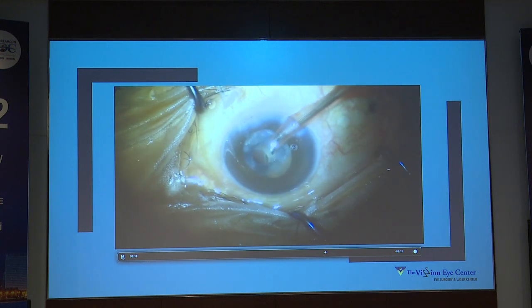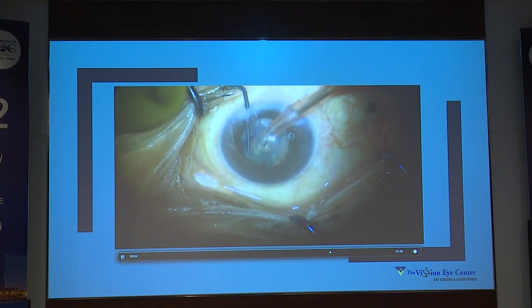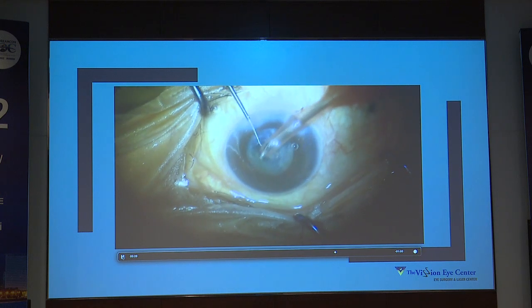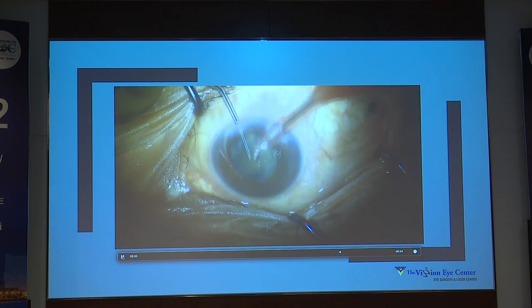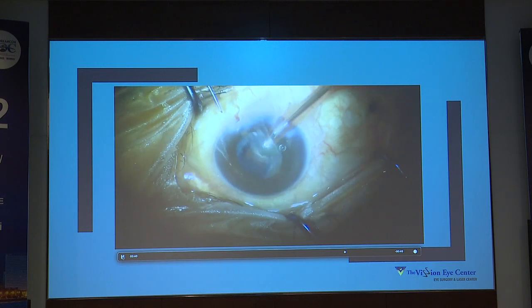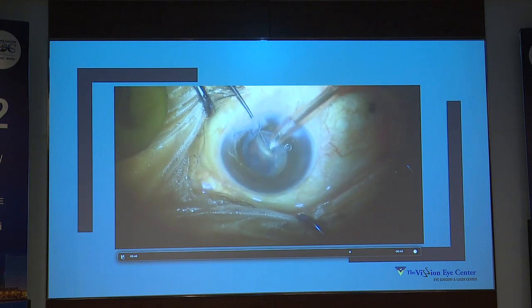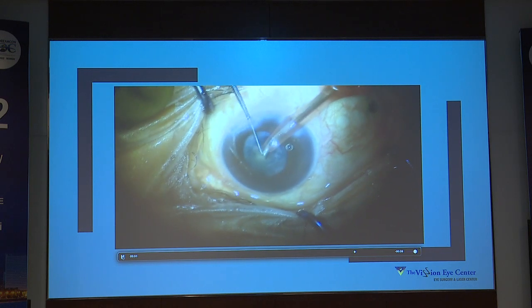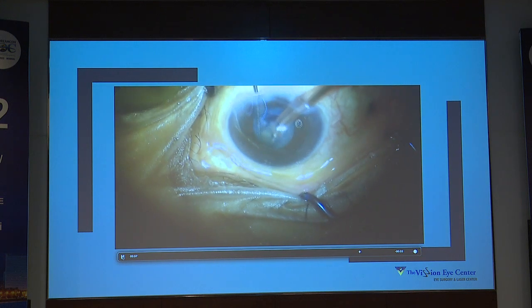Okay. Some breathing space, you manage to get some space for the nucleus to move. Again, it's not a free movement. And as I said, if your rhexis was smaller, you could get into trouble because you're not concentrating on your rhexis margin. Trying to be at the level below the iris plane, not trying to get fluid too much into the anterior chamber. Moving to the later part, I'm still with the phaco probe inside the eye. I don't want to come out, as I said, because the moment I come out, the viscoelastic will walk out, the iris will walk out.